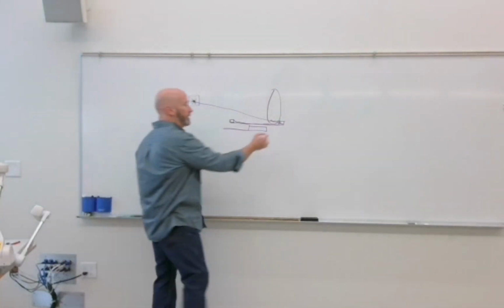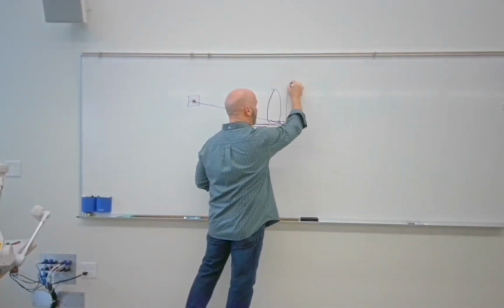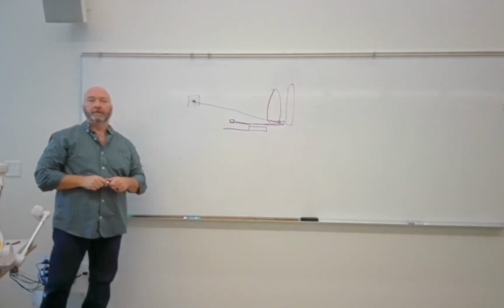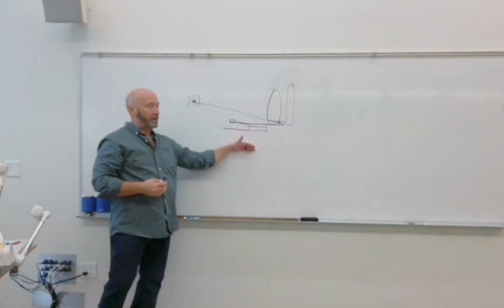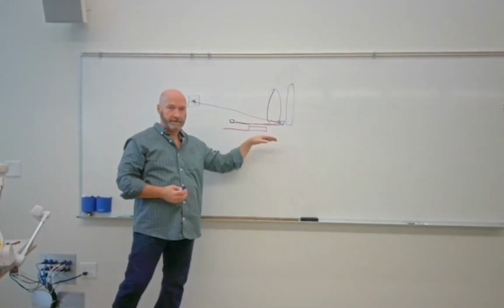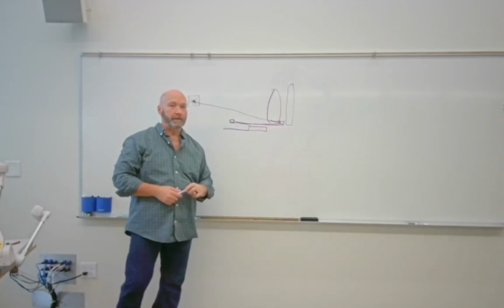If I put my image receptor right here, and this is a metal support for the table, what am I going to see? Air fluid levels? No. You're going to see a big chunk of metal. Right? So the problem with our curved tabletop is that we have to contend with this stuff. So how can you get that out of the way?